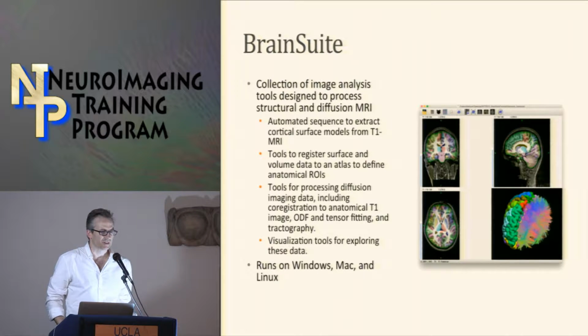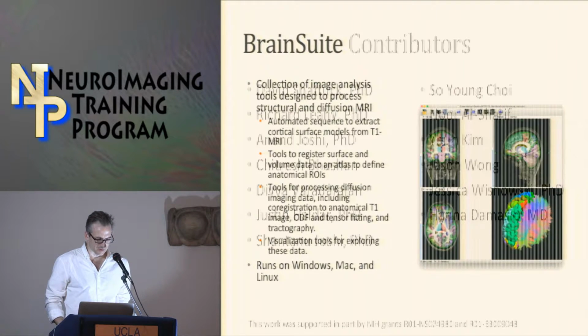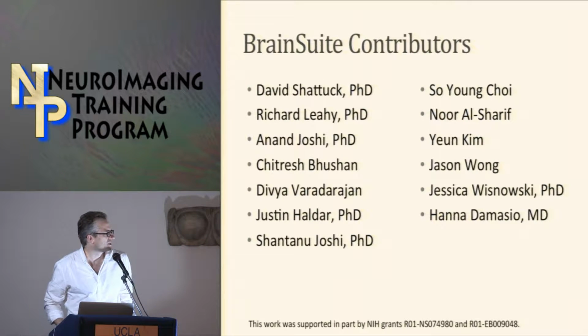We don't have the Linux GUI built for release yet, but it can be built, and we'll be distributing that later this year. I don't know how many of you use Linux by preference, but if you're gung-ho, you can compile it yourself as well. We're hoping to get a distribution out soon.